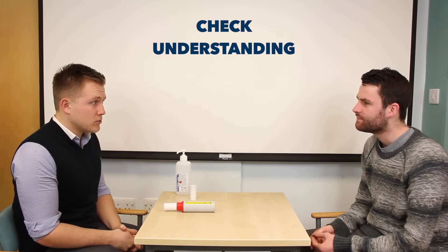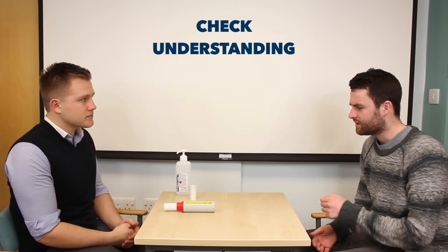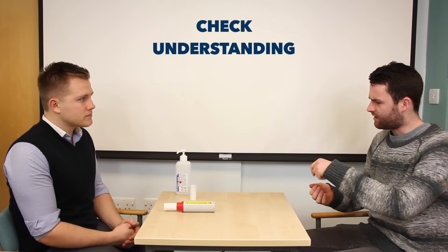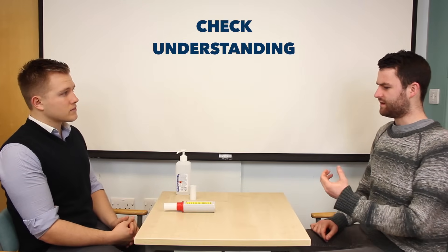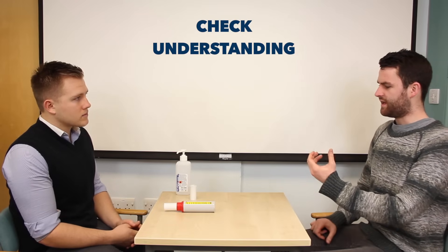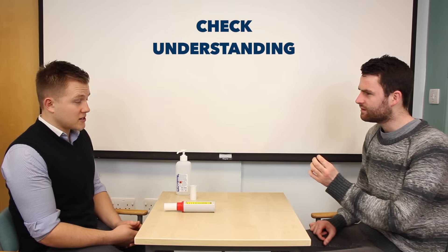Was that all quite clear? I think so, yeah. Brilliant. Would you like to just repeat to me what you've learnt so far? Sure. So I need to put my own mouthpiece in, set the dial back to zero, and then sit up nice and straight, and then take a nice deep breath in as far as I can, and then breathe out as hard and fast as I can as well. That sounds perfect.